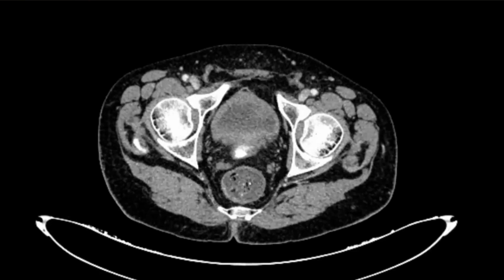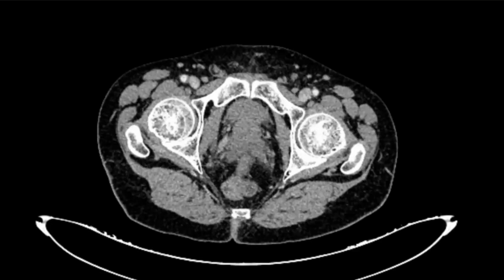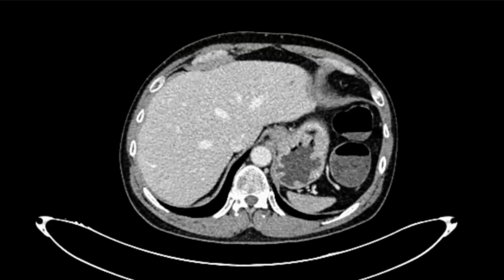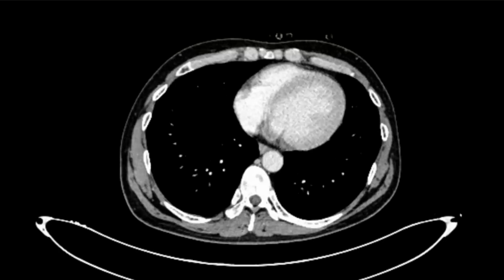The patient mainly had upper abdominal pain. So just try to focus on the upper abdomen. And he had complaints of some episodes of gastroesophageal reflux. Does that help? Just try to look for the anomaly now.